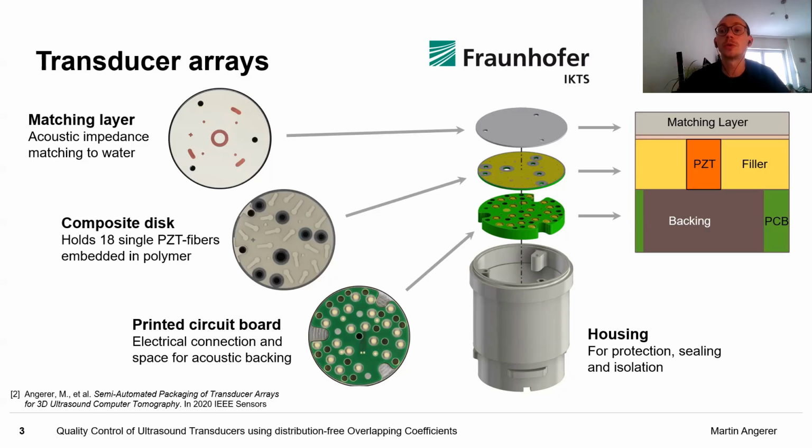From the quality control point of view, two main fabrication defects have to be found. These are cavities which might form directly in front of or behind the PZT fibers, which on one hand would cause very low acoustic impedance matching and therefore low emission sensitivity, and on the other hand, significantly reduced functional bandwidth and high reflections, which cause artifacts in the image.